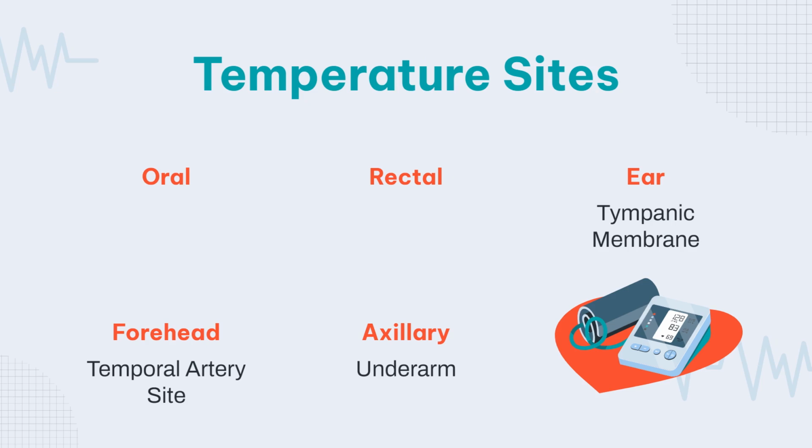Next, you can take temperatures in the ear, the tympanic membrane thermometer. The tympanic membrane has fewer microbes than the mouth or the rectum. This route is comfortable and not invasive. The site is not used if the person has an ear disorder or ear drainage.